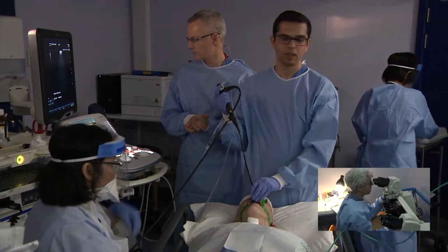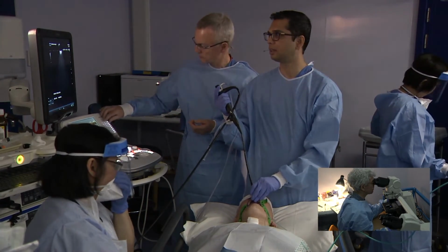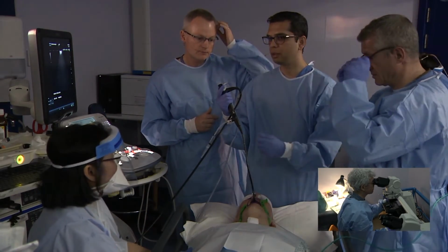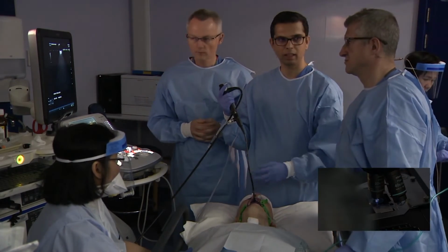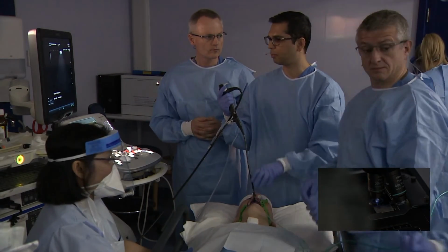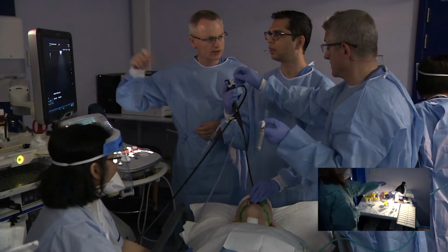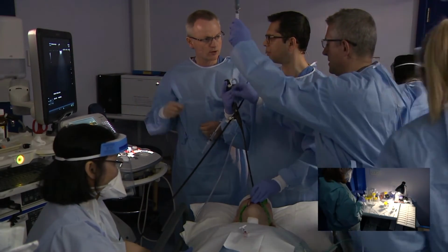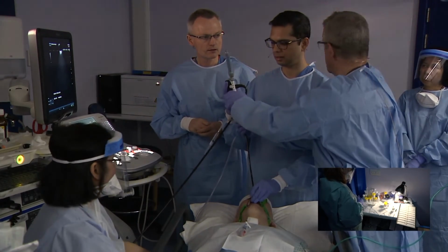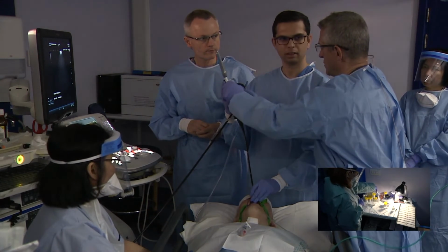One of the benefits of transcricoidal infiltration, at least we found in our practice, is that despite a low level of sedation, the patient is quite comfortable. Now he does cough every time the needle is taken out, and I'm sure Andy will agree with me, we have seen in our practice that whenever the needle comes out, patients do tend to cough a little bit. Is this because it's irritating the cartilage ring, or the mucosa? Still, just for the benefit of the observing audience, pass 1 into that node was diagnostic.